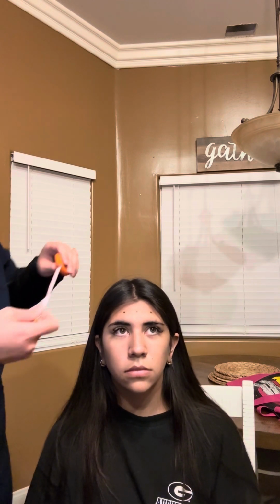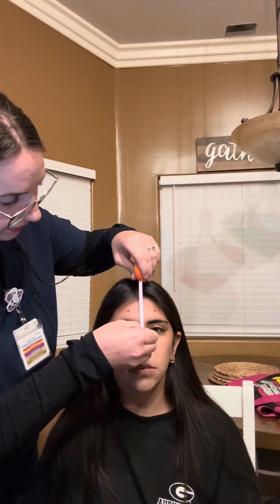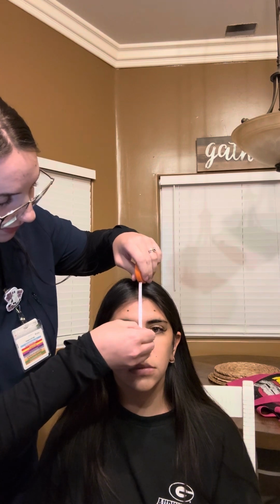To get your FPZ, you want 10% of 35.5, which is 3.55. Sorry, I'm trying to look at my notes. I went ahead and already did that, so I had 0 and then 3.55. Then you want to get the FZ, which is 20% up, so 7.1 centimeters.